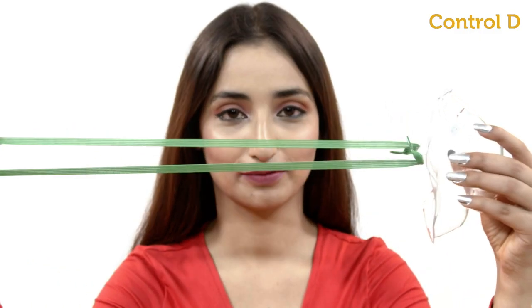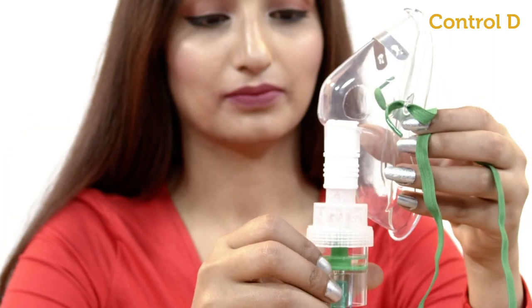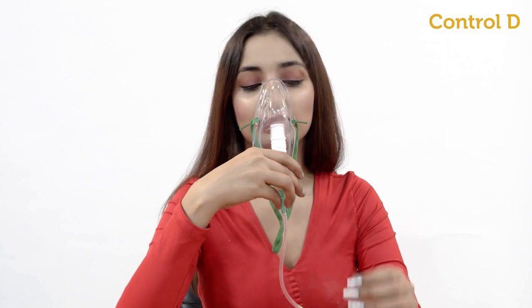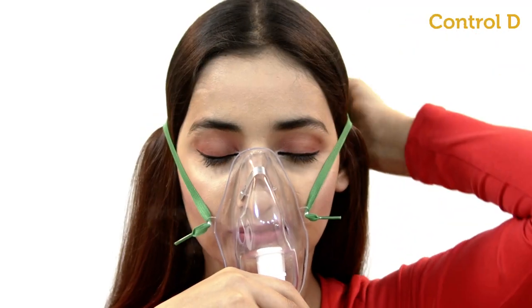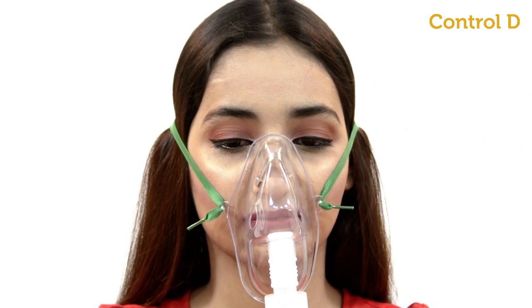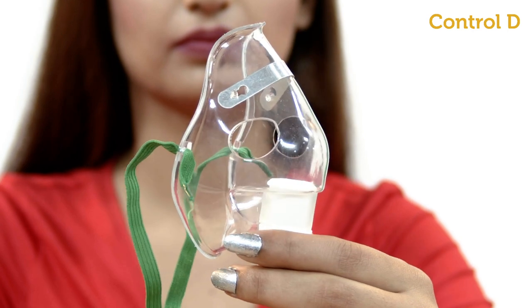Choose the suitable mask. Attach it to the medicine chamber. Put the mask over your mouth and nose. Take slow and deep breaths so that the medicine goes into your lungs. Breathe till the medicine is over. Use the child mask for kids.